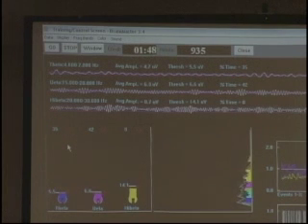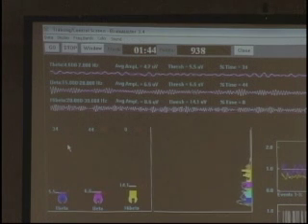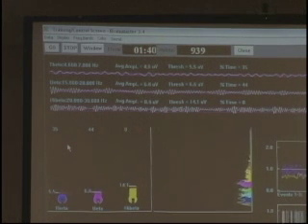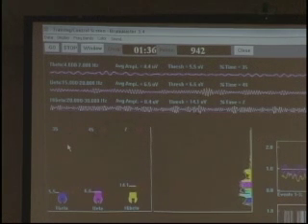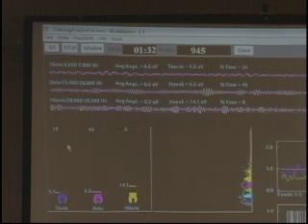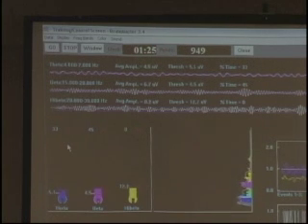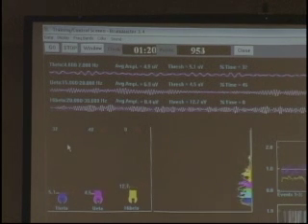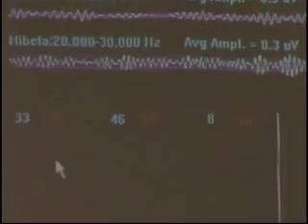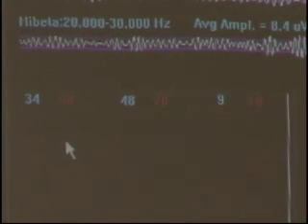Now let's say I wanted to change the beta and make it 70 — what key would I use? B key. Exactly. So as I hit my B key 10 times, I've taken it up to 70. It's not working. Well, if your session's over, it's not going to work. And then again, I've made a change, I hit the Y key. Is it the red number that's changing? The red number at the top is changing, and then you hit the Y key to change the thresholds based on that new target. As you're making that number go up with beta, you're making it easier, whereas going up on theta made it harder — theta's inhibit, beta is a reward.